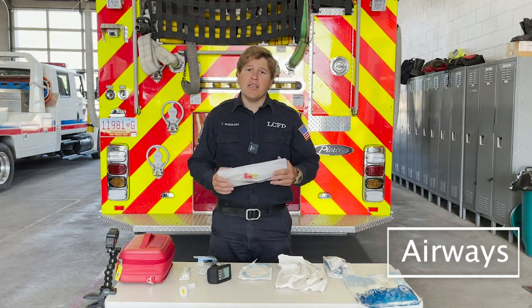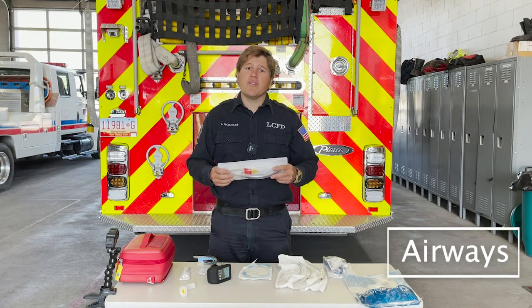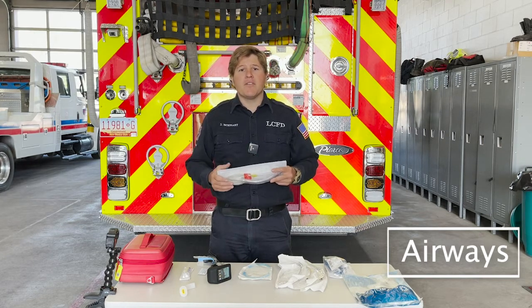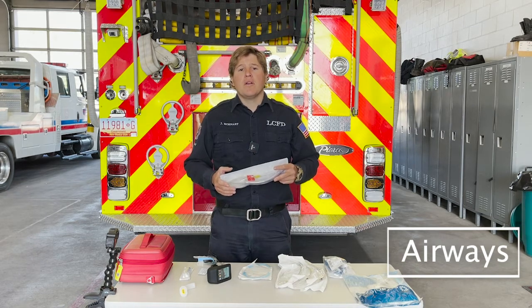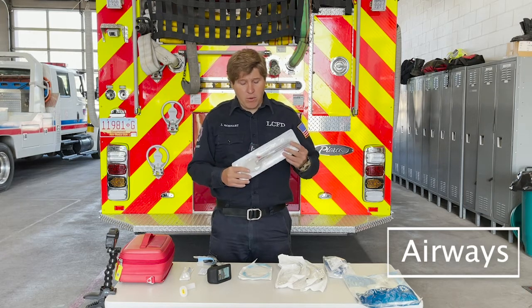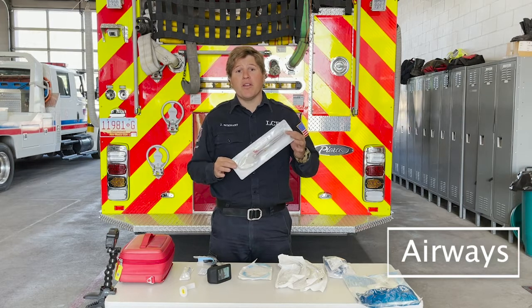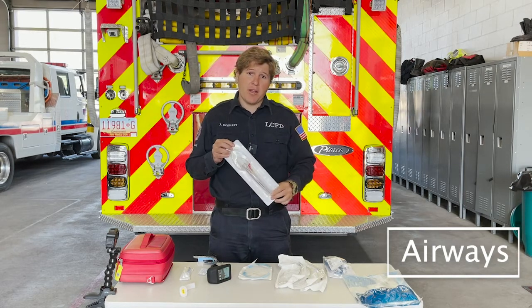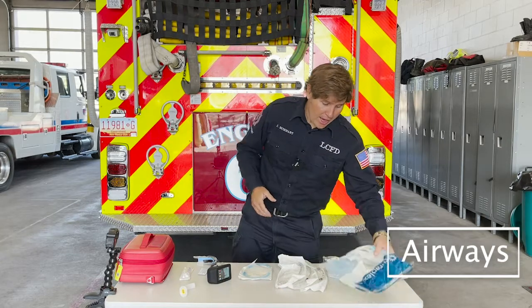And lastly, if everything you did is right, you run through SODA, you've done everything you can, sometimes it's just a difficult airway, or there's things that we can't overcome that will make it impossible or very, very difficult to place an airway. So have your secondary airways ready to go. Your advanced airways, in our case an LMA. If you do have a failed airway, then have this ready.